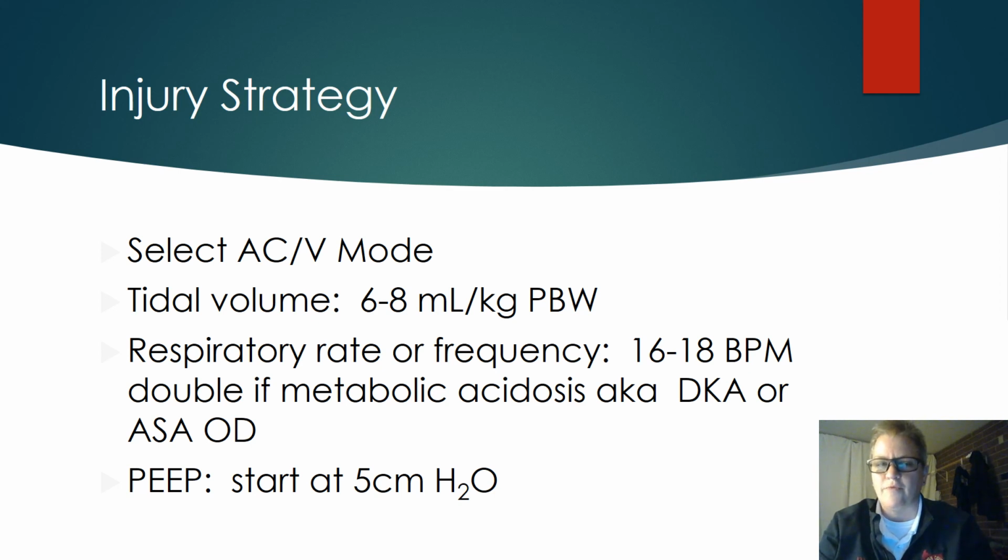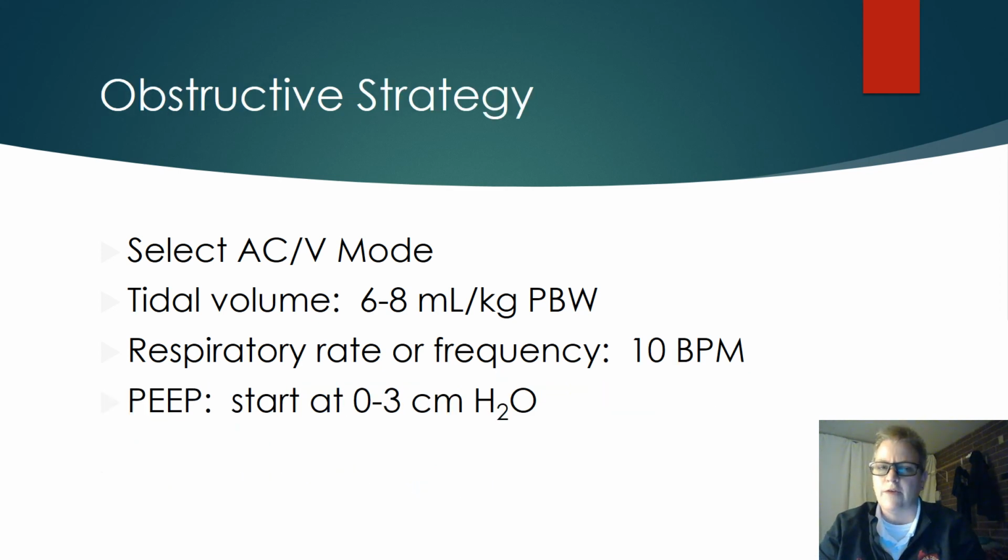Pretty easy. Okay, let's talk about the other strategy, and this is our obstructive strategy. This is our asthma and COPD exacerbations, okay? They need time to exhale, okay? So our respiratory rate is our protection here. In the injury strategy, our tidal volumes are our protection. We don't want to cause ventilator lung injury, okay? In our obstructive strategy, these folks need to be able to exhale, okay?